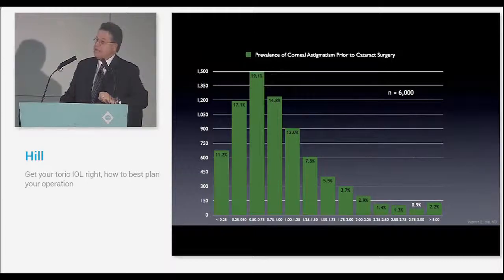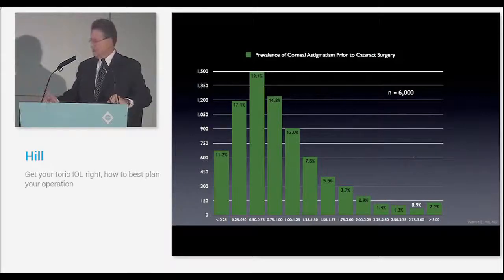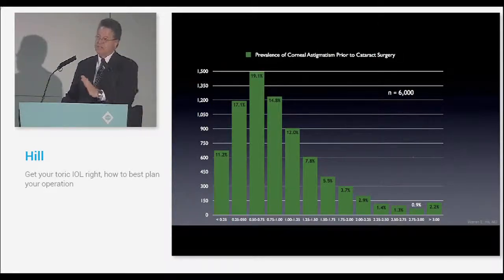Now, why is it even more important to know how to do this correctly? Well, most of your patients are low astigmats. It's the high astigmat that we remember, but it's a low astigmat that walks through the door. And if you have a low astigmat, it's more and more difficult to determine the steep meridian, because it's sort of soft, especially if you do it on manual keratometry.